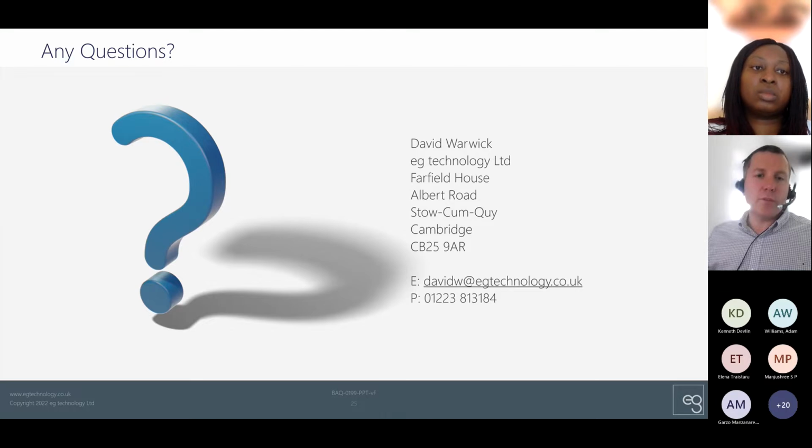Yeah, lots and lots of different scenarios. But as I've said several times now, I think you try and write it down, but then also don't forget that context of what the software can realistically help with. If the software is giving you support for your diagnosis, it can't then influence what the clinician does with that information. So the software can't mitigate the clinician making the wrong decision if you've presented the right evidence.